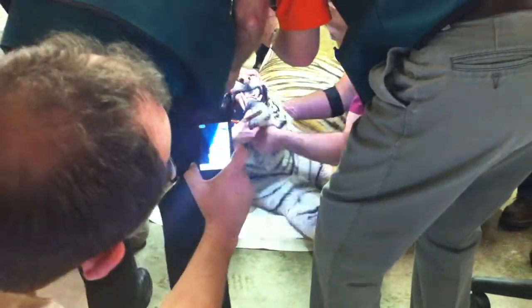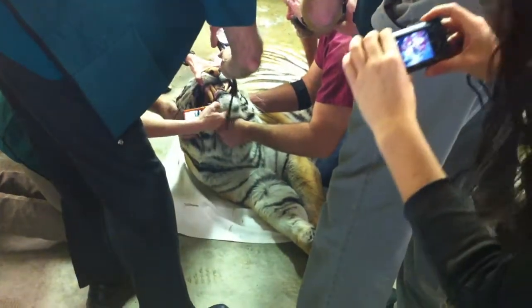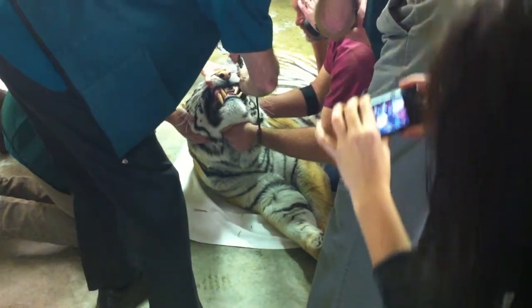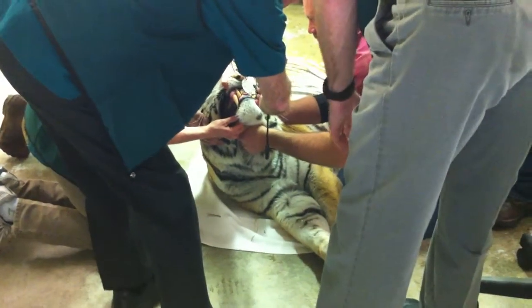Did you get some photos of that, Chris? Yes. She split. That came in and split.